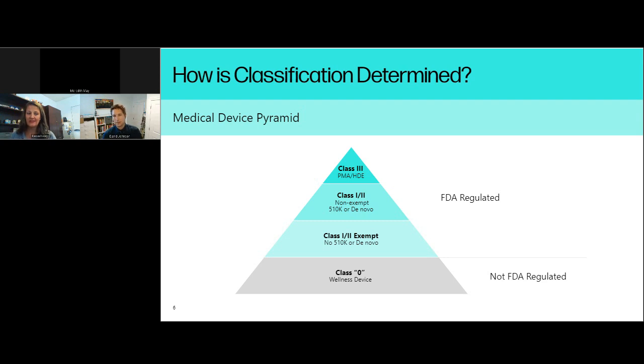Sure. So at a simple level, class 1 is really anything that comes into contact with the human body and then goes away. So any mechanical testing that we may do for a class 1 device usually lands in the arena of a marketing or a white paper or answering specific questions around that technology. It is the least common amount of testing that we do. For class 2 devices, you have to show that you're substantially equivalent to something else that already exists on the market. And that measure of safety and efficacy is the actual mechanical testing. So in the substantial equivalence table, there's 12 or 13 different types of things that you have to show substantial equivalence. Mechanical test results, which include static and dynamic testing to an ASTM or ISO standard about a specific device, always occur for a Class 2 device.